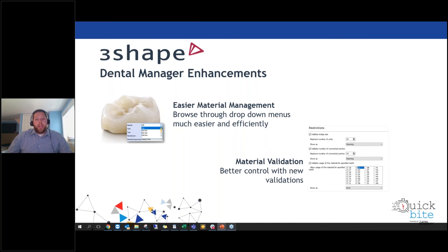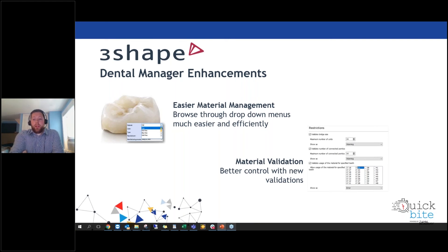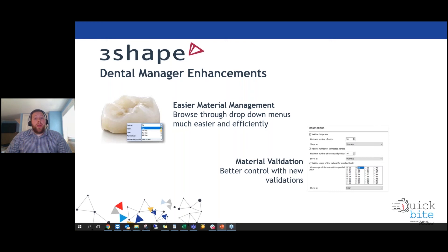Another enhancement is materials validation in Dental System 2020. New validations and restrictions deliver better control when producing restorations. Preferences are set within the control panel according to specific materials and their respective applications — customizable by individual tooth type or process, whether full contour crowns or substructures. This option is located in the material section under basic elements in the dental system control panel, allowing manufacturers to control and validate their materials based on their needs and specifications.